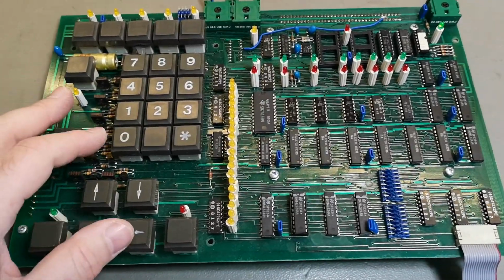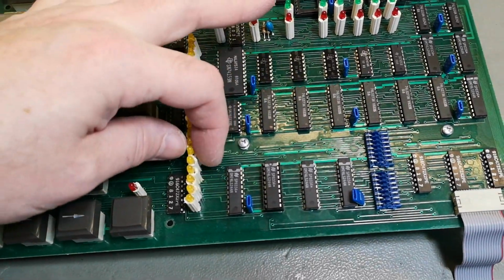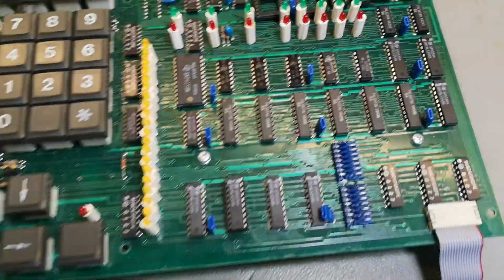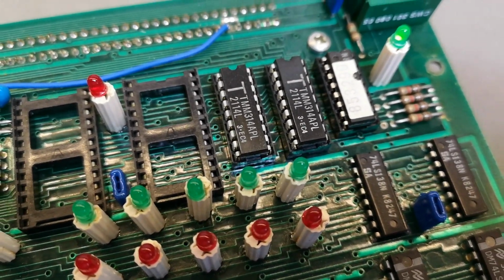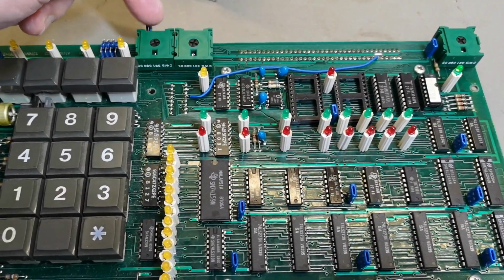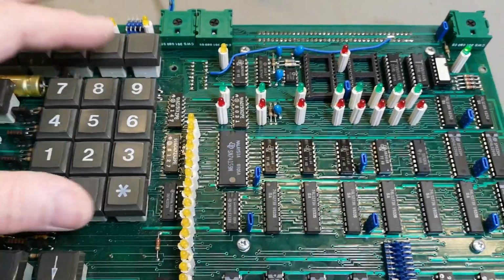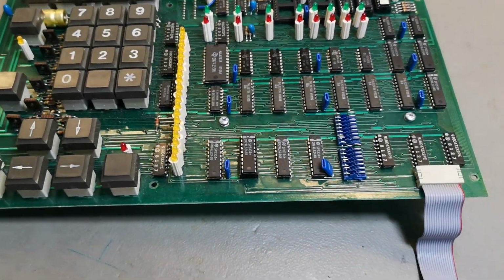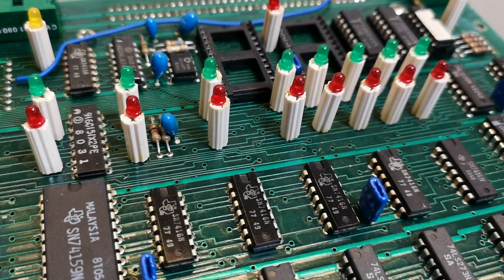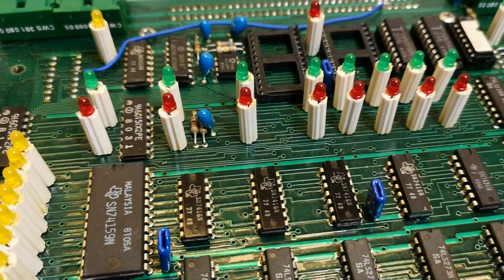So here is the top side of the keyboard and indicator board. There's actually quite a lot of ICs and stuff here, and of course it's because it's driving a lot of LEDs and reading all those buttons. And I think that is actually memory we got right there. Probably a chip select programmable part as well, and I think we got those for calibration, so probably for frequency and level calibration. But still I'm not able to find where this is not working. Oh, by the way, the standoffs for all the LEDs, can you see? Where have you seen those before? That is so funny.